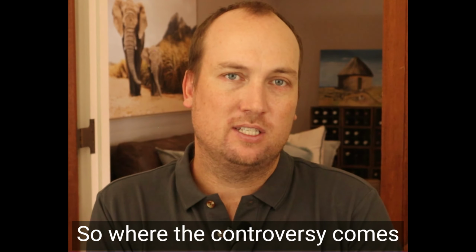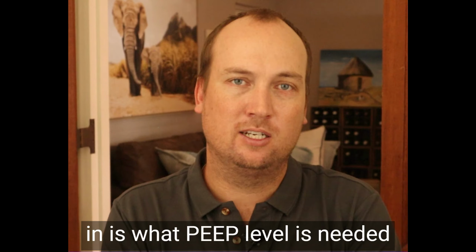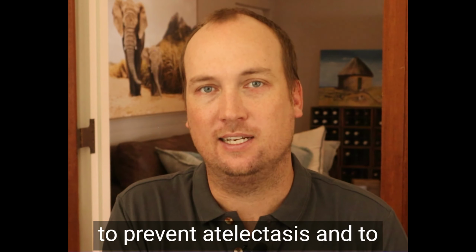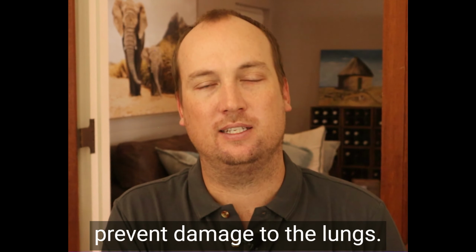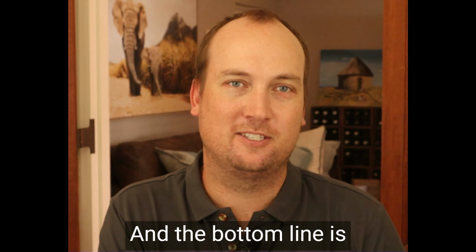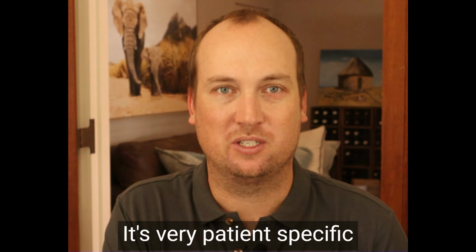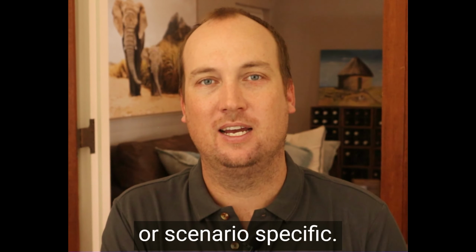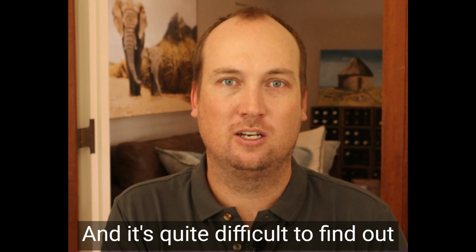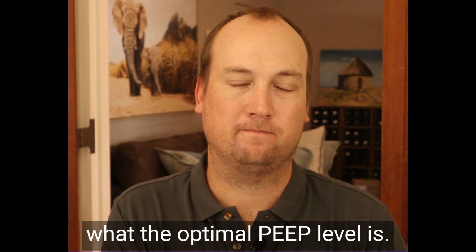So where the controversy comes in is what PEEP level is needed to prevent atelectasis and to prevent damage to the lungs. And the bottom line is that it's very variable, it's very patient specific or scenario specific, and it's quite difficult to find out what the optimal PEEP level is.